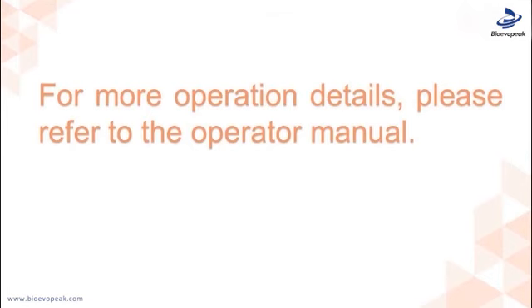For more operation details, please refer to the operator manual.